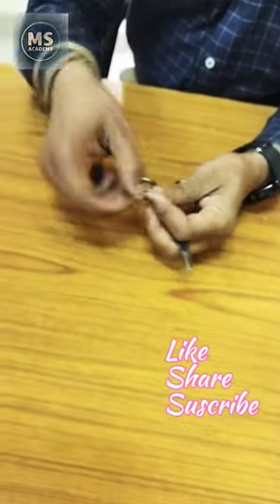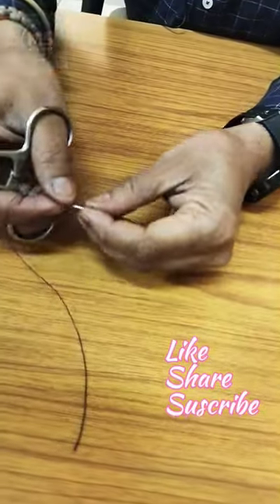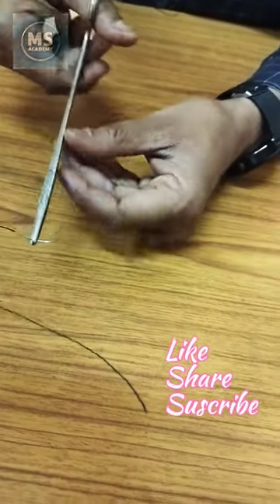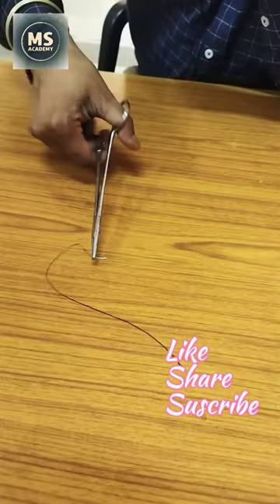Now I am going to tell you how we can hold the needle. We have put the needle in this way. We can hold the needle in this way.